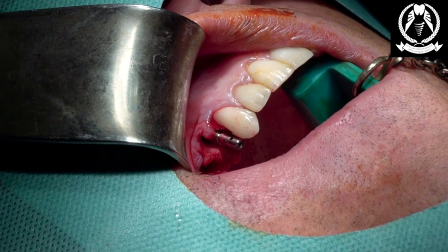Give me the measurement. Go onto that. Use the mouse. Go onto that space distal of the bigger defect. Tell me what implant we have.